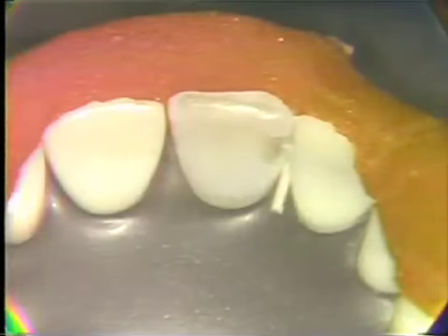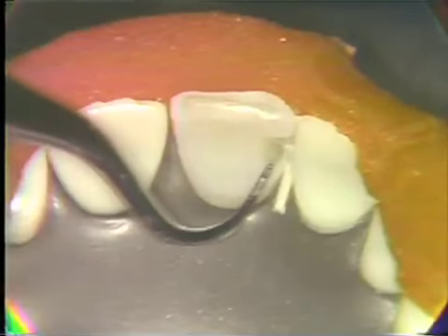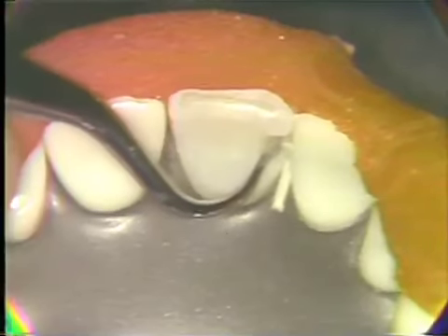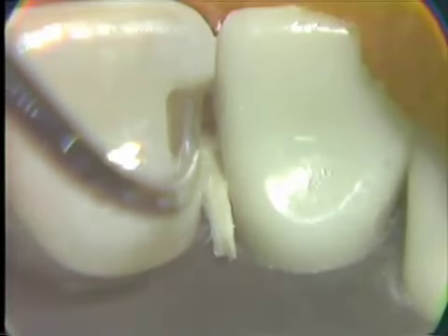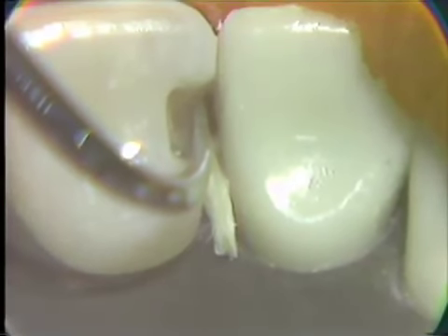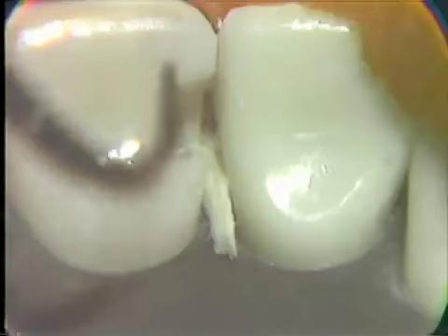The opposite end of that instrument is going to lay against the axial wall and be able to condense from axial wall position on out into the labial margin area.